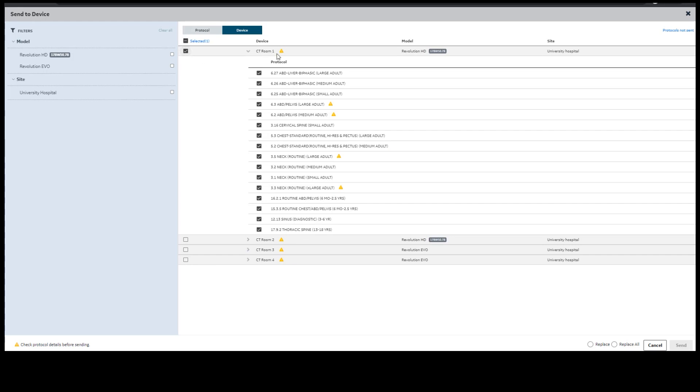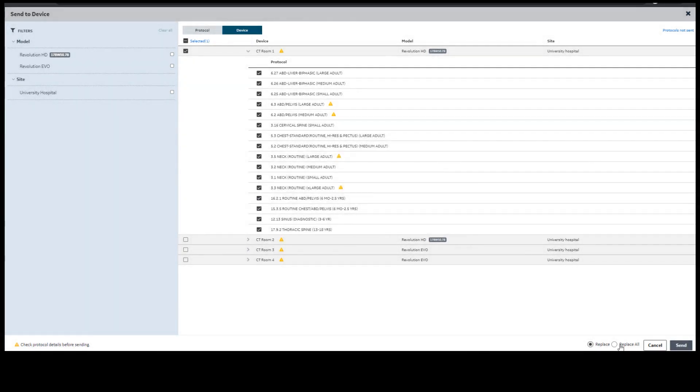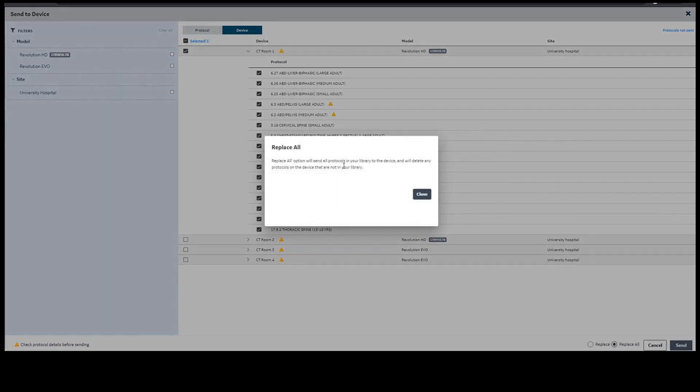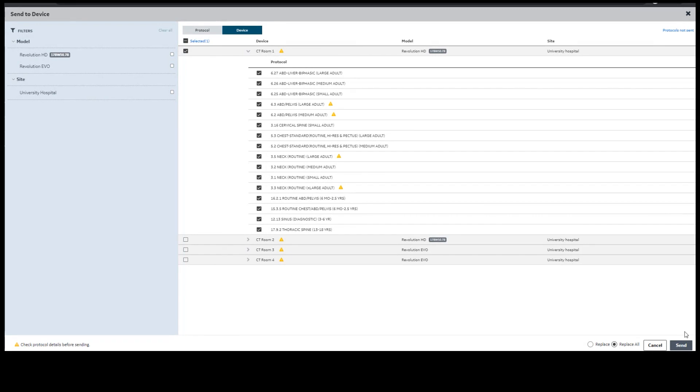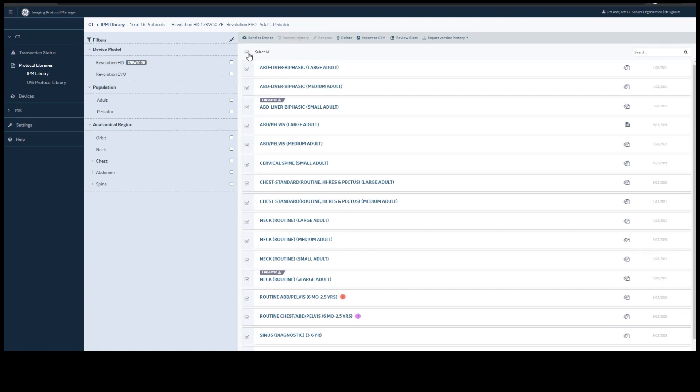Once you have decided which protocols you want to send, you can replace, which will add or update the protocols on the devices, or you can replace all, send the protocols to the device and delete any protocols on the device that are not in your library. Simply press send. Those protocols go to a staging area on the device. Please note that the device must be rebooted for the changes to take effect.